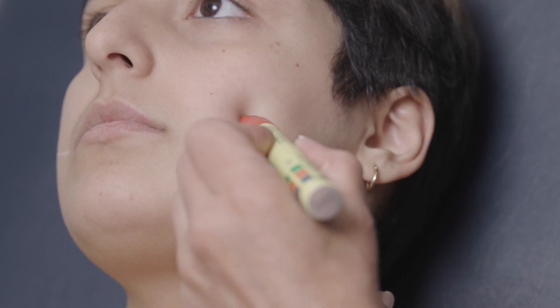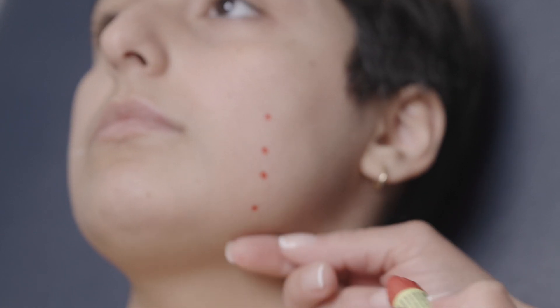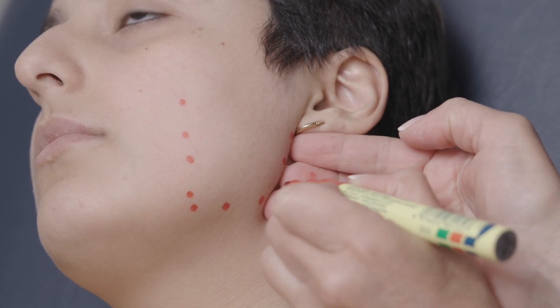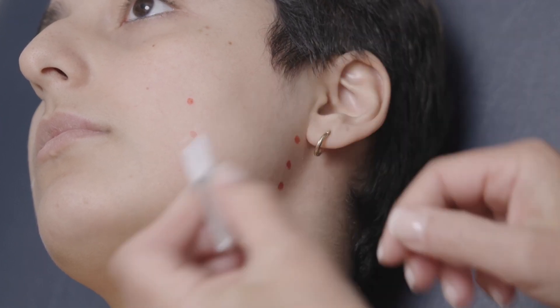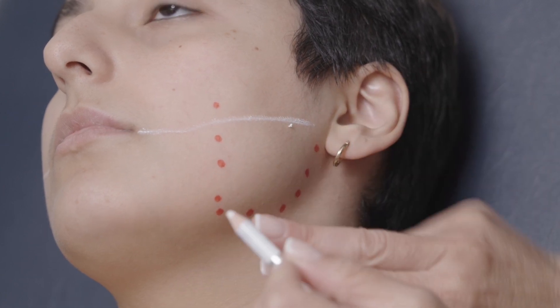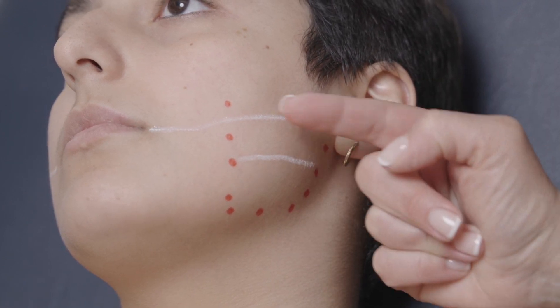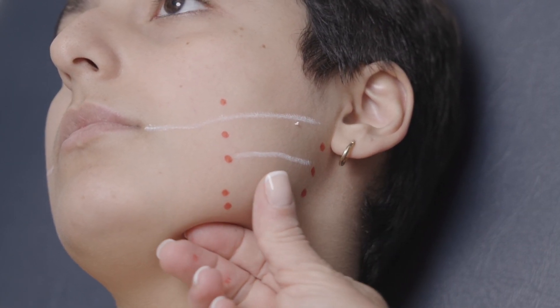Can I ask you to clench? We're identifying the anterior border of the masseter along the mandible, the ramus, and a line from the oral commissure to tragus. The injection points will be in the lower half of a line that divides these.